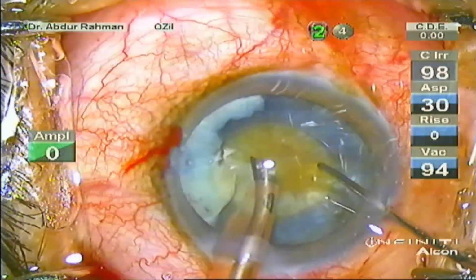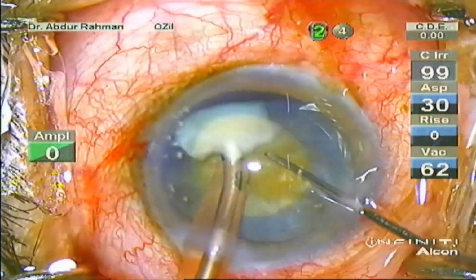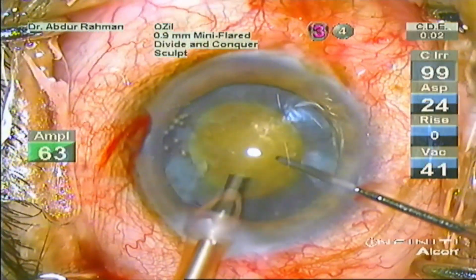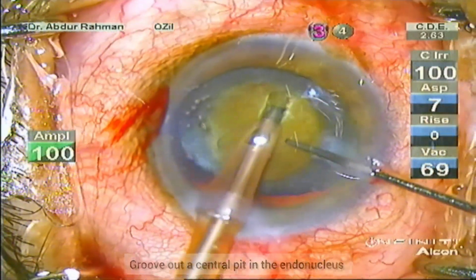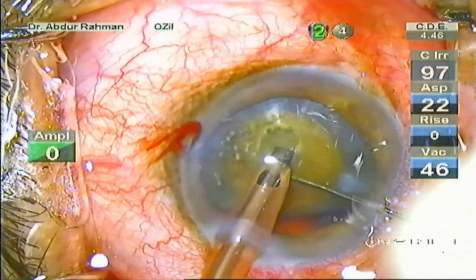Now in pre-phaco mode, eat up the loose cortex. See that the fluffy part was the loose cortex or the epinucleus, loose epinucleus. Now sculpt out a central groove in the endonucleus.